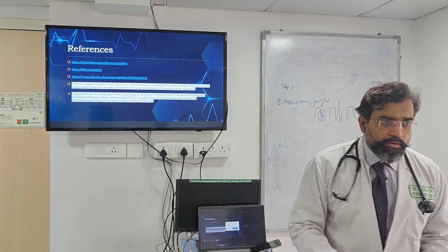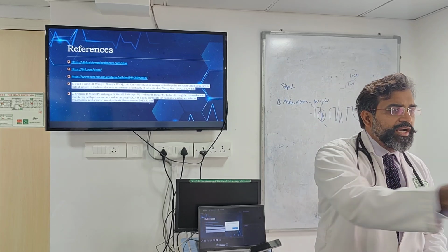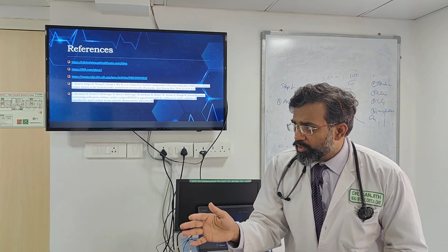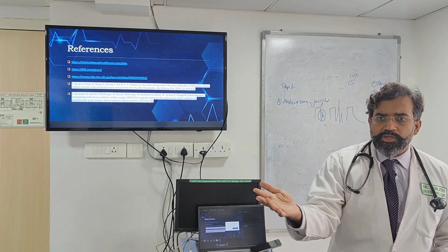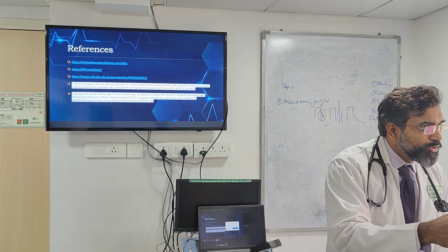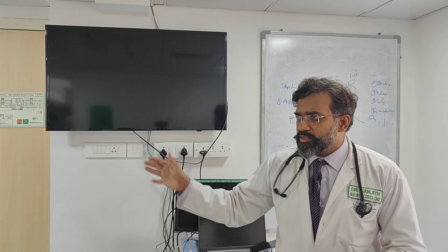One of the proposed reasons why people use TPDT all over the world is because the nurse can do cardiac output monitoring and give you a call. That means in a hospital abroad, the nurse can do transpulmonary thermodilution and then call us up and say this is the cardiac output. So it becomes easy for the doctor. But that requires training. When they go through that training, then they can do that. So don't assume that our nurses are completely trained. We have to ensure that this is done.